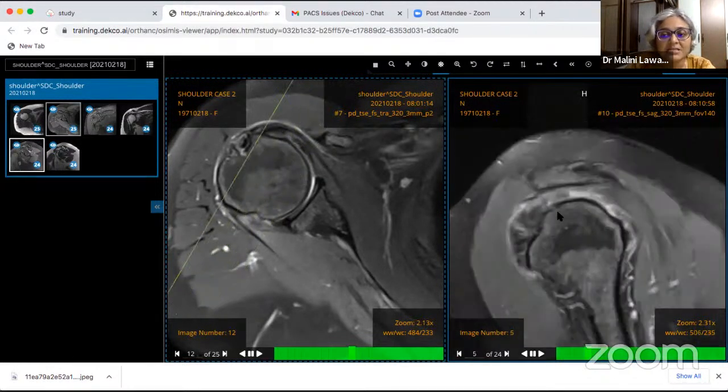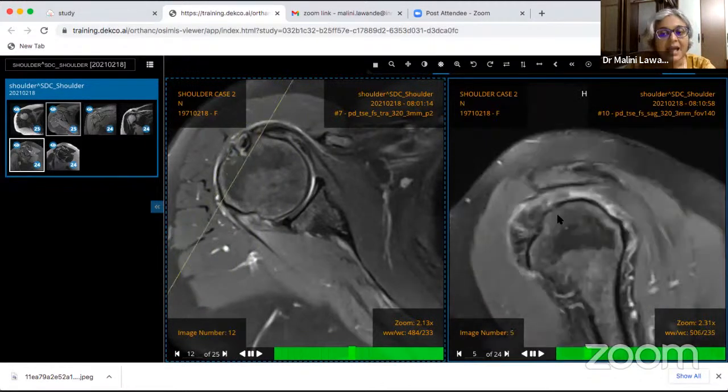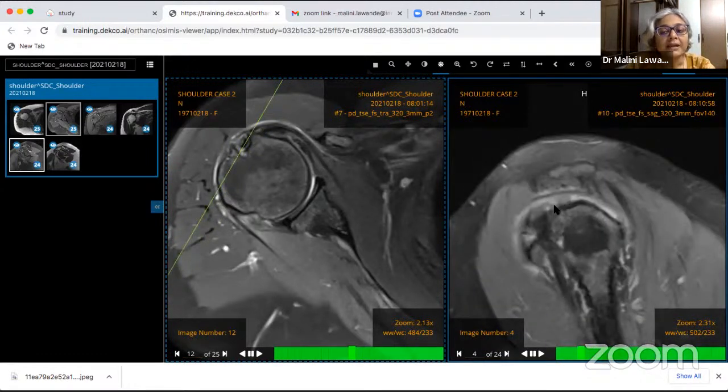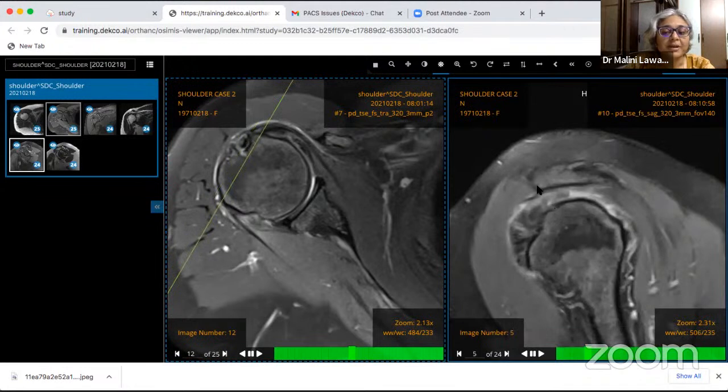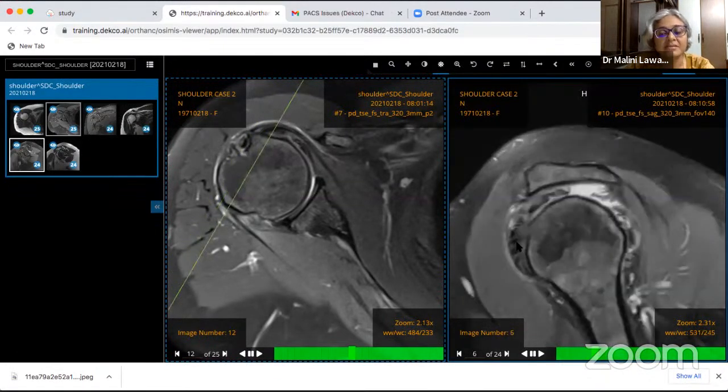So this patient has a full thickness tear of the infraspinatus and the supraspinatus tendon with retraction up to the medial humeral head. Few intact anterior most supraspinatus tendon fibers which show severe tendinosis. Moderate to greater subscapularis tendinosis with a small interstitial tear near its insertion. Mild biceps tendinosis. And can you see here this osseous projection?